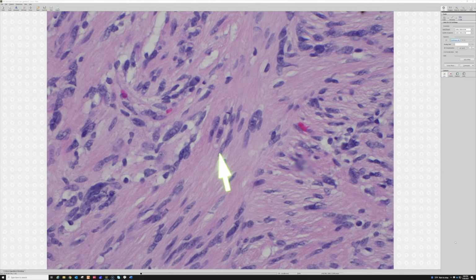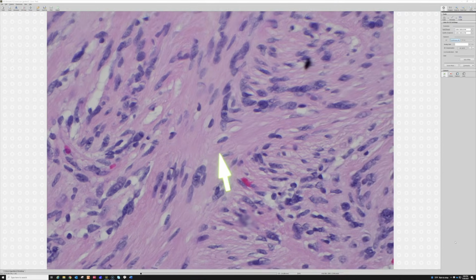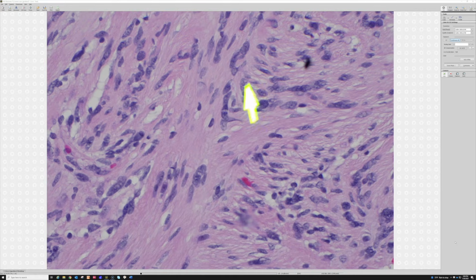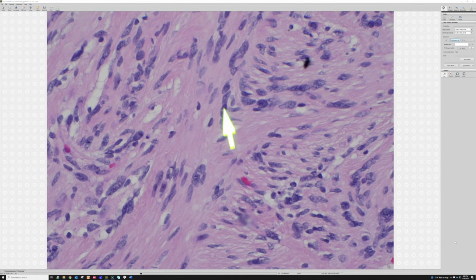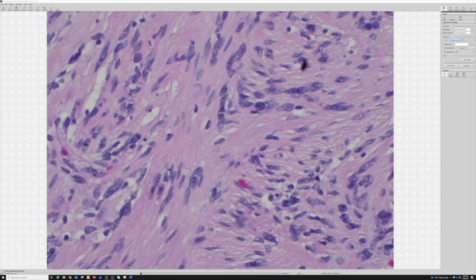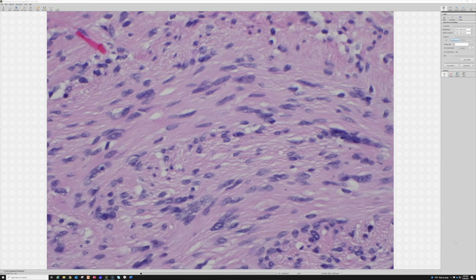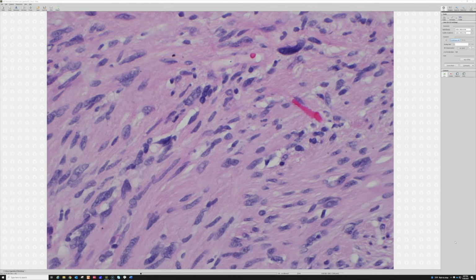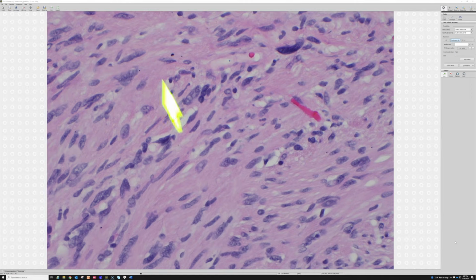The other thing that Mark taught me that I found really helpful is this. Schwann cells like to be in pairs, partnered up end to end, where you have one Schwann cell and then here's another. There's actually maybe 3 or 4 right here, but see how they're in a little row, and the blunt ends butt up against each other, right? Like you took two bullets and put the flat side back to back. And hopefully YouTube doesn't ban this for talking about bullets. But in any case, I'm not advocating anything. I'm just trying to make a visual reference. So there, you can see them where they touch, right? You have one and then another one touching right against each other.